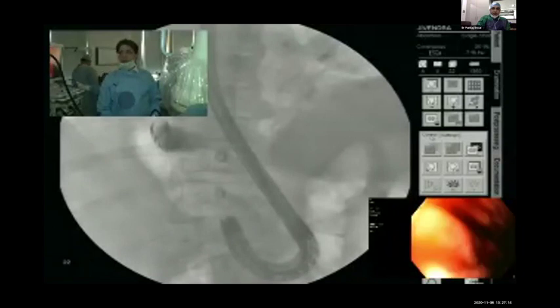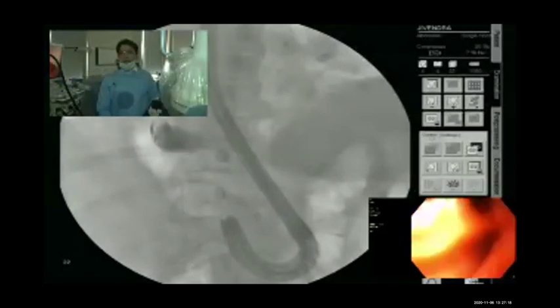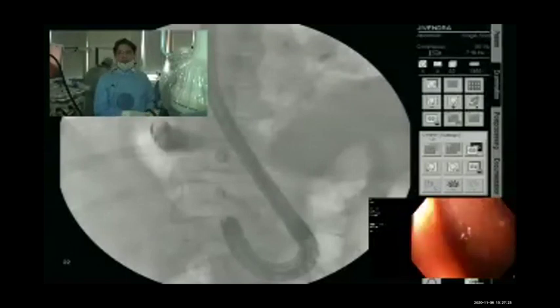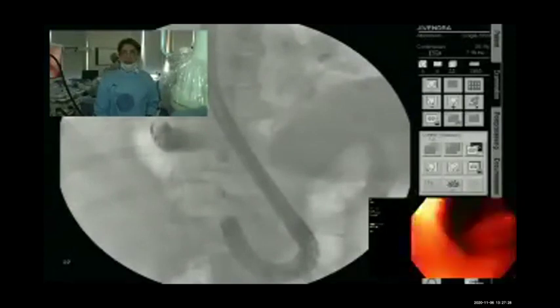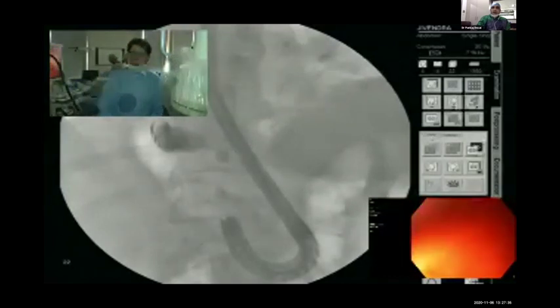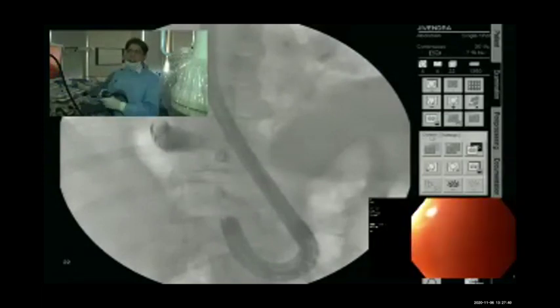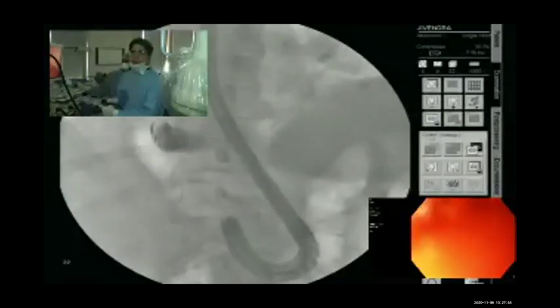And we don't see the adequacy of the obliteration. That is the most important thing. Here we have seen obliteration, and I was quite confident that even if I don't inject endoscopically, this bleeding is going to stop, because I have already done the EUS and I have seen the complete obliteration. Right. This is probably from the perforator which was still feeding it. So if you use the coil followed by the glue, the amount of glue required is less, and the number of coils required is less. This is the advantage of using the combination of both.